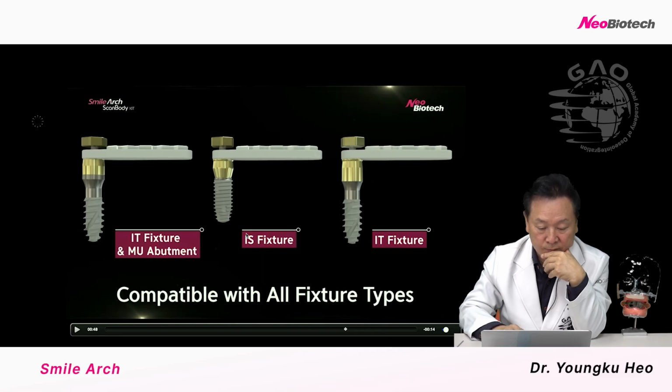And this is the scan post, a different type of scan post. It fits in the MUA, and it can also fit in the implant itself, like the bone level implant, the BL fixture, and also the tissue level implant, which is the IT.